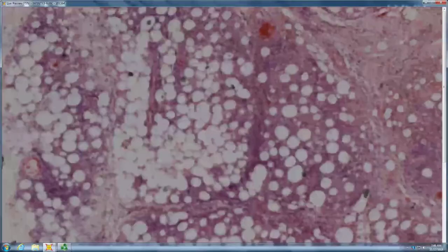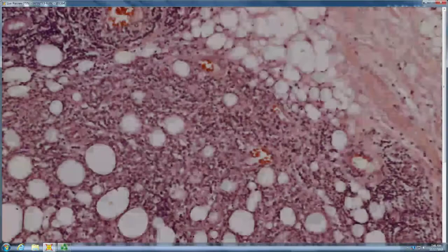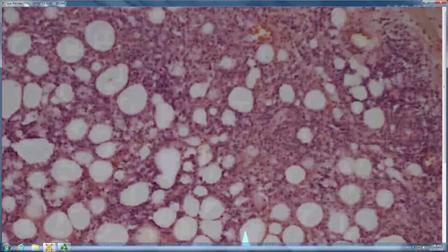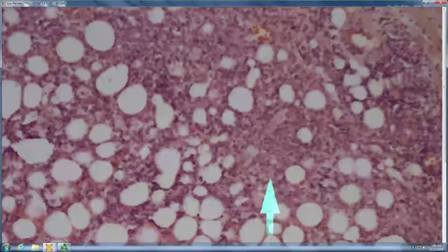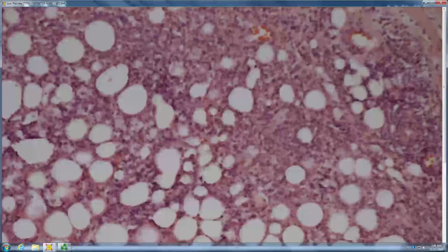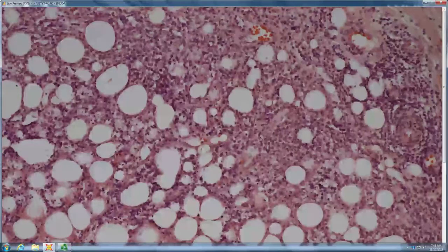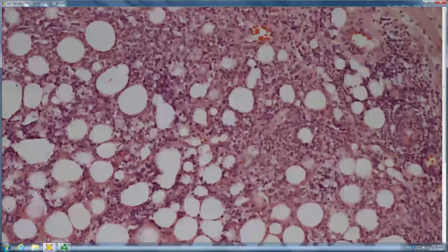Lobular panniculitis, and how would you characterize it? What kind of inflammatory cells? It's histiocytes and lymphocytes. And what are the little fragments here? Neutrophil debris. Yeah, so it's suppurative and granulomatous panniculitis. So tell me about suppurative and granulomatous panniculitis. What are you thinking? Infectious, alpha-1 antitrypsin.